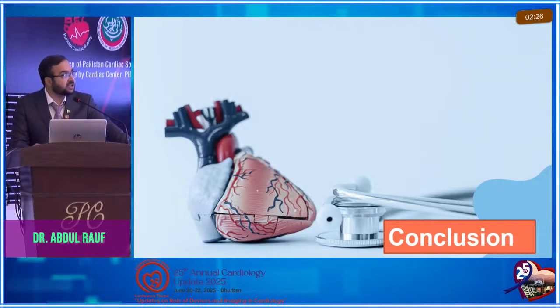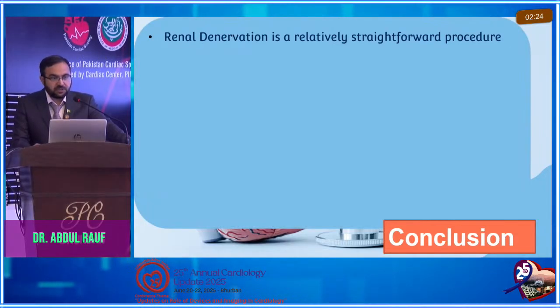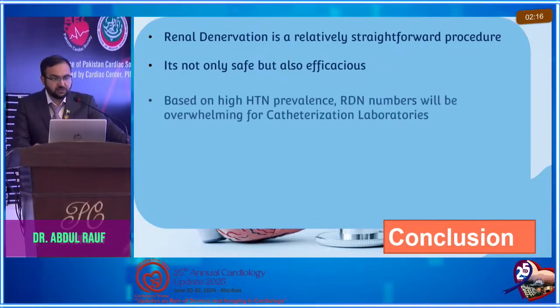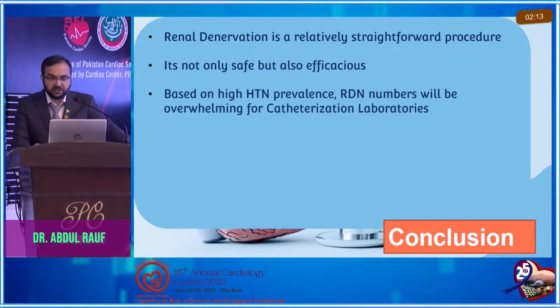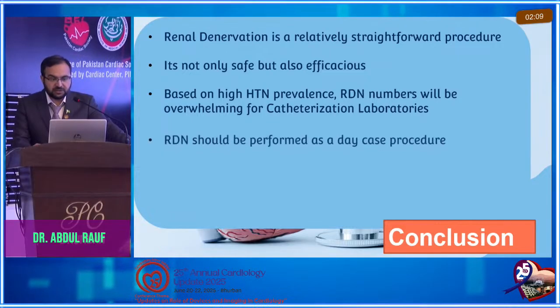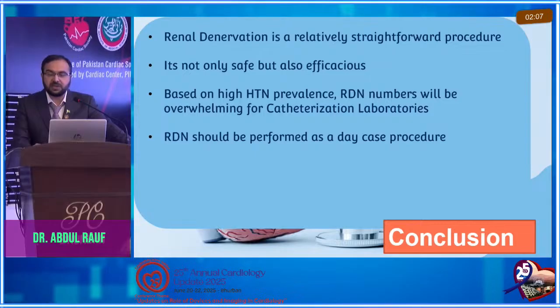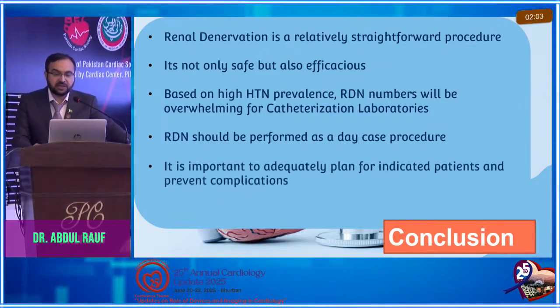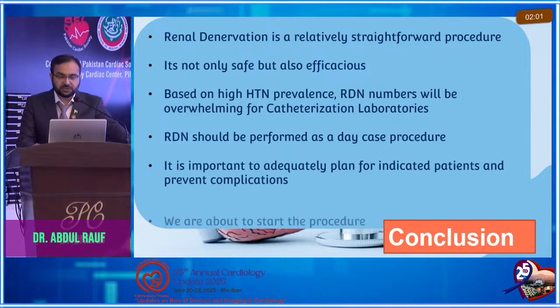Now coming to the conclusion, renal denervation is a relatively straightforward procedure. It's not only safe but also effective. Based on the high hypertension prevalence, in future RDN numbers will be overwhelming for catheterization laboratories, and RDN should be performed as a day case procedure. It is important to adequately plan for indicated patients and prevent complications.